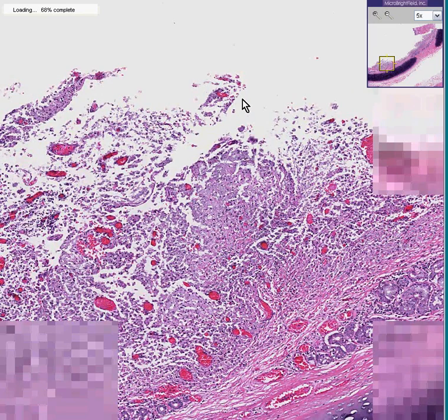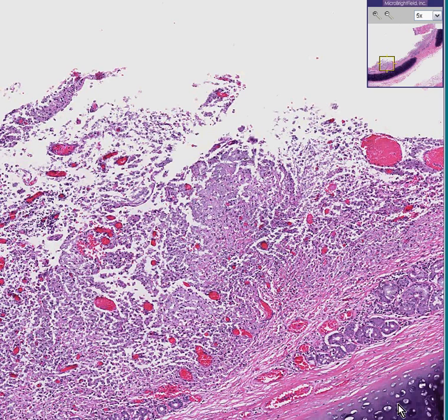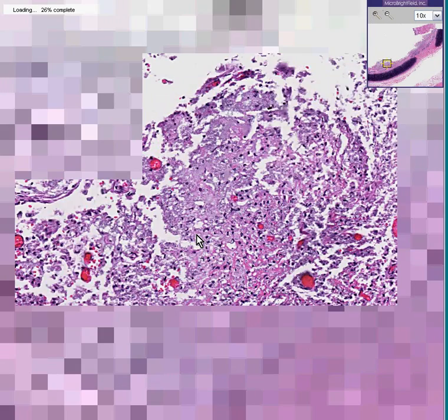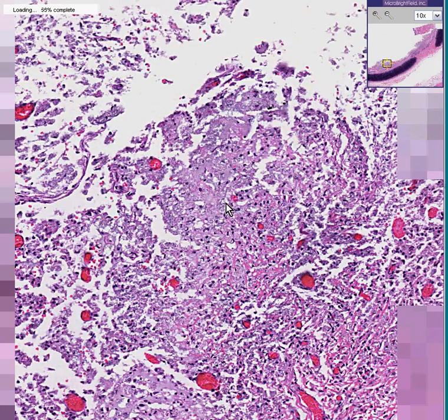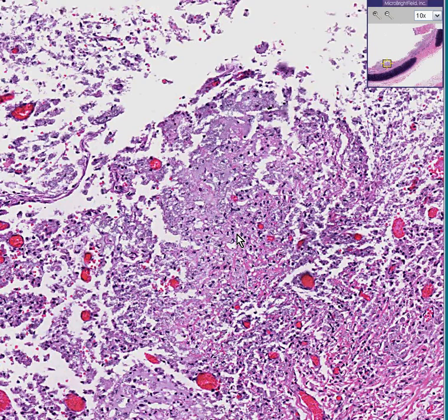I don't see too many remnants of epithelial cells, which in the bronchus would be pseudostratified ciliated columnar, but I do see some submucosal mucous glands underneath this nice hyaline cartilage. The mucosa appears to be destroyed and inflamed, replaced by granular necrotic material which has fibrin and acute inflammatory cells. This is acute bronchitis.